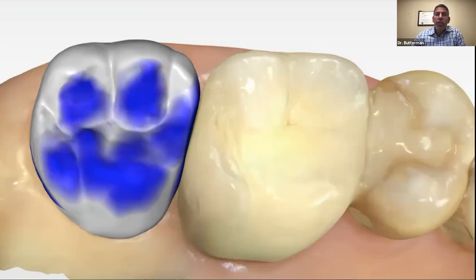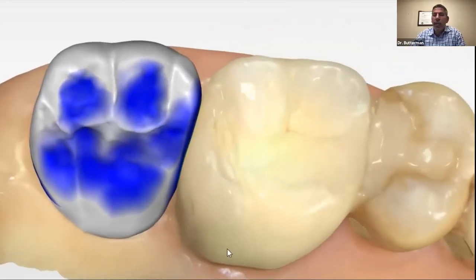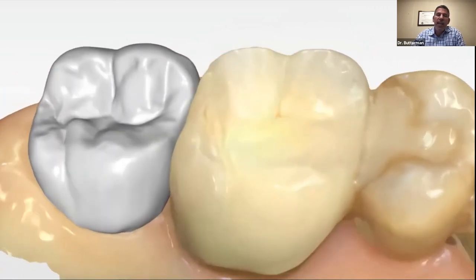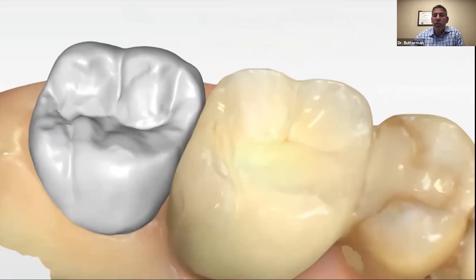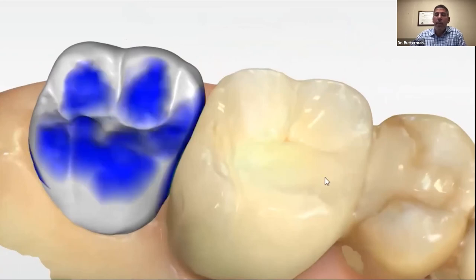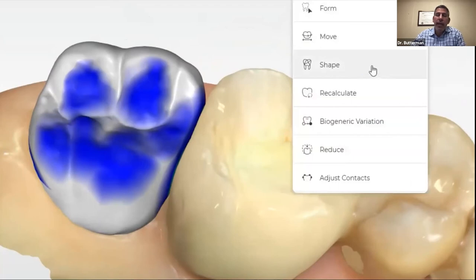So here's what it looks like when I'm doing my design. If I get a proposal that looks like that, I'm not going to accept this proposal. I'm going to use my shape and my circular tool. I like to turn the colors off just so I can see the anatomy better and see where those inclines are. Then I'm just going to use my shape and my circular tool, go to that mesial marginal ridge, and lift that up.